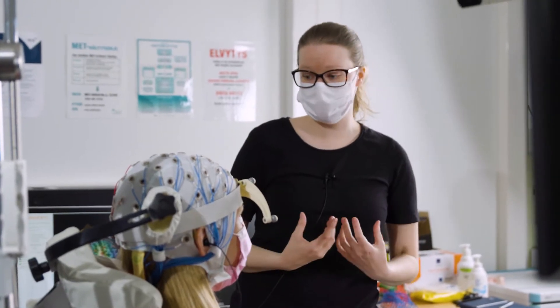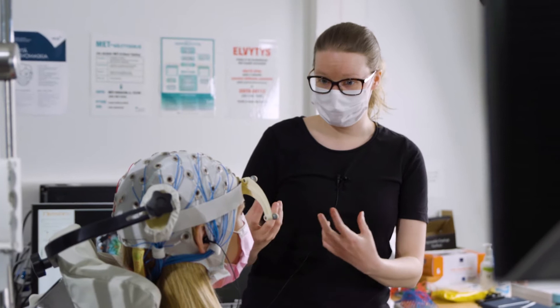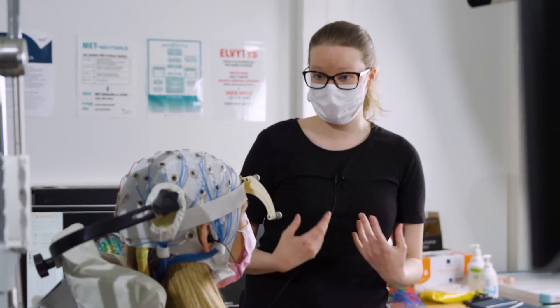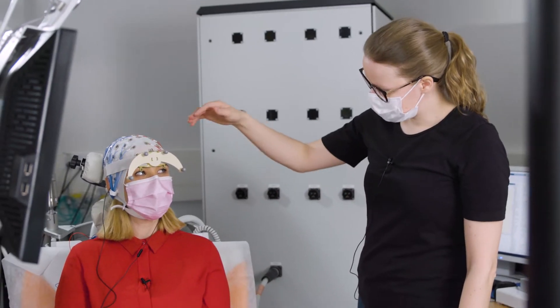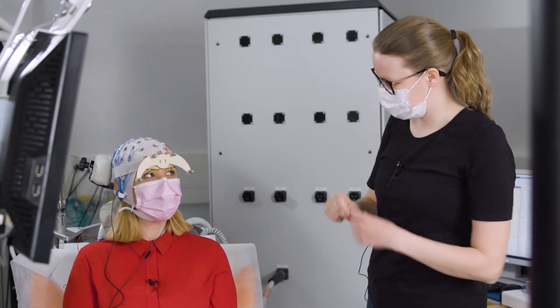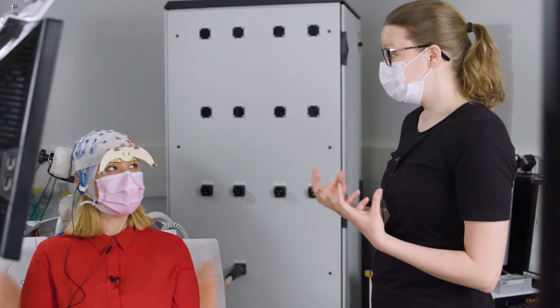So what the brain stimulation does — what kind of activity it creates in your brain. And this headband here we have adjusted because we want to follow where your head is.